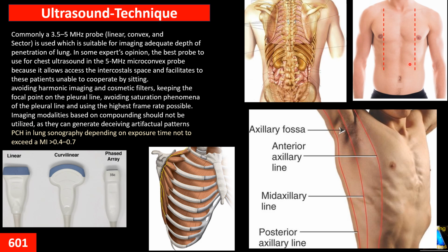How do we do the scanning in that situation? At the anterior, we put at the mid clavicle at 2 spots, one of them superior between the second and third intercostal space, and another below the nipple at this level. And then we go for the mid axillary. Here we have the anterior axillary line and posterior axillary line. At mid axillary we go upper part and lower part.